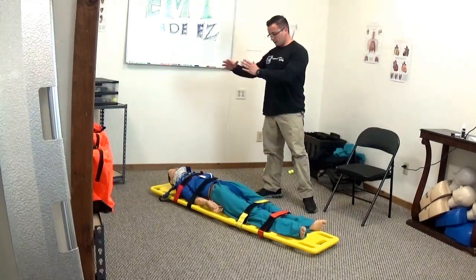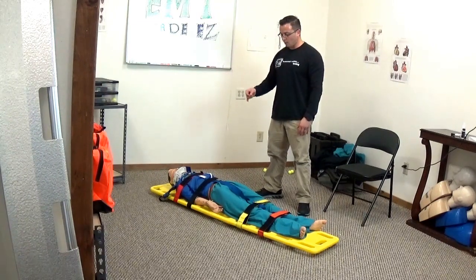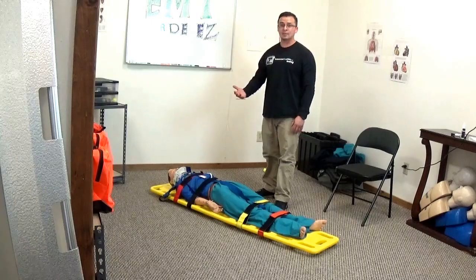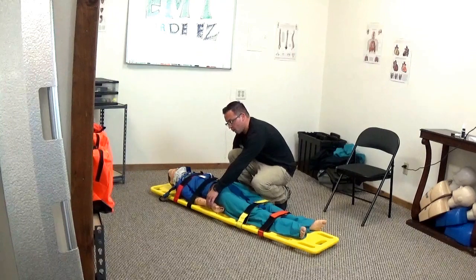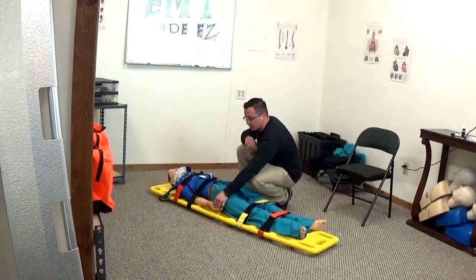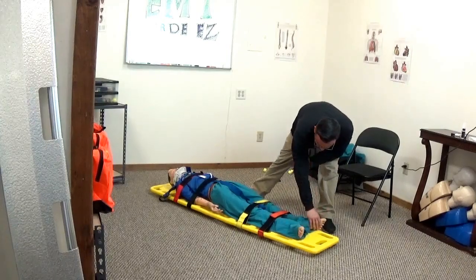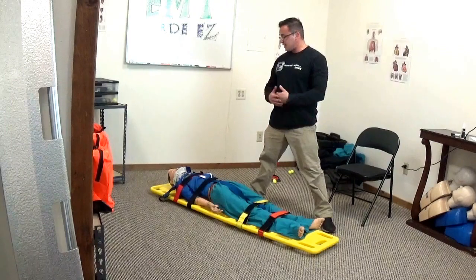So the order is: torso, head, then legs. Now secure the upper extremities onto the board. The last step is to recheck CMS. Check for radial pulses — are they present? Have the patient squeeze your fingers and ask which finger you're touching. Then check pedal pulses, have the patient press down and push up, and ask which foot or which toe you're touching. And that's it for the entire scenario.